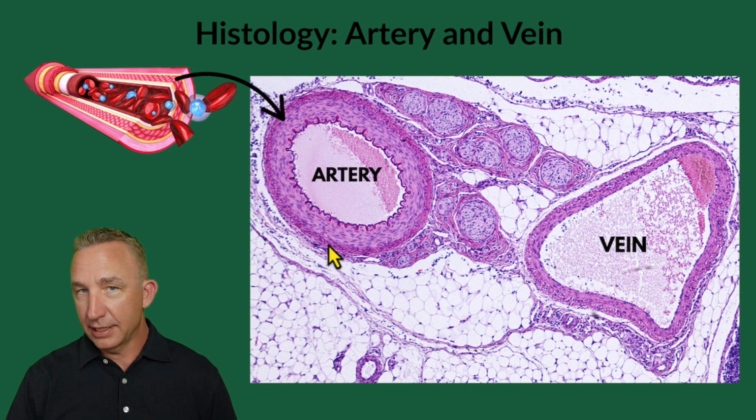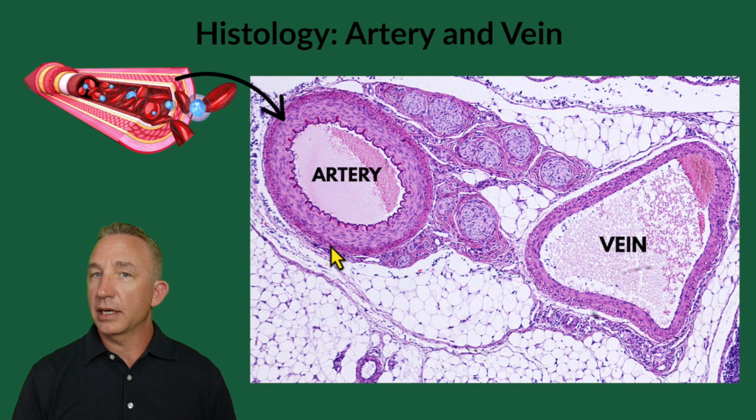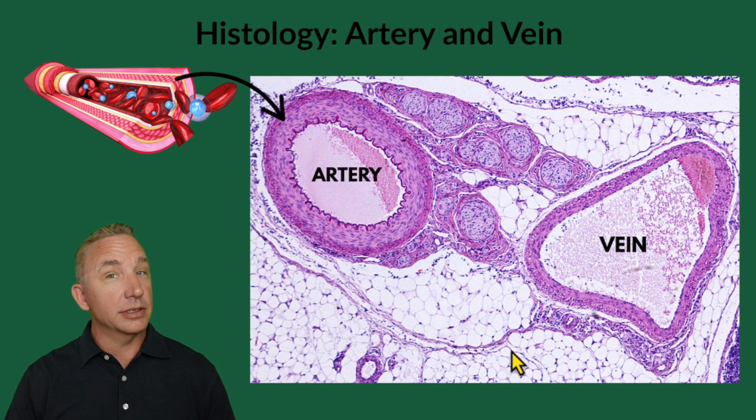And then this is connective tissue. So I have epithelial tissue, muscle tissue, and connective tissue. So you start to see a trend through the whole body that we use the different types. And then I have nervous tissue on this side. And then you can see a lot of these little bubbles. These are adipocytes. This is adipose tissue to support all the vessels.